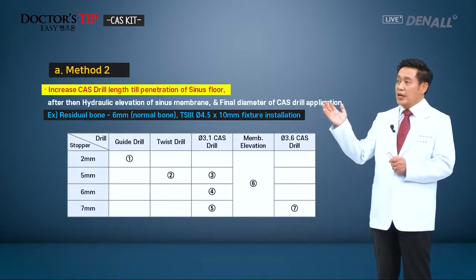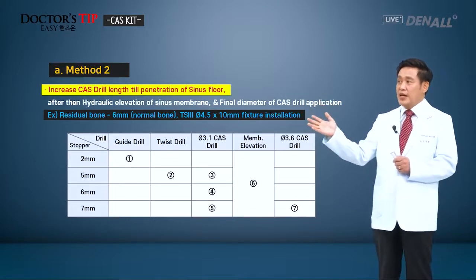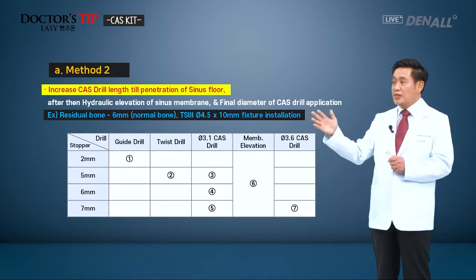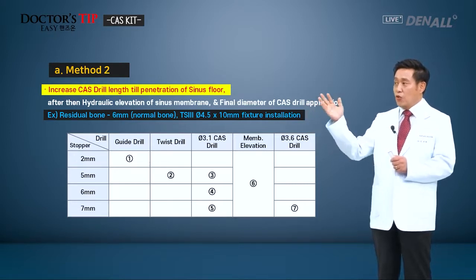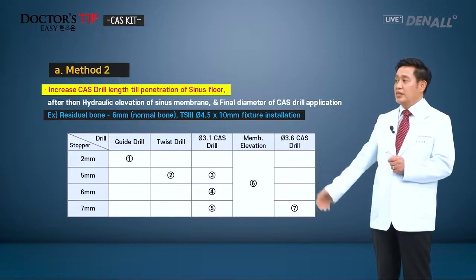The second method, the CAS drill length is increased until penetration into the sinus floor. CAS drills are used to penetrate the sinus floor, followed by the hydraulic membrane elevation, and the final drill is used to do the widening.